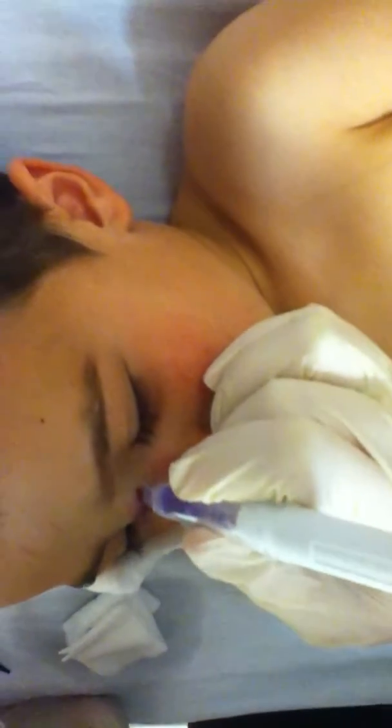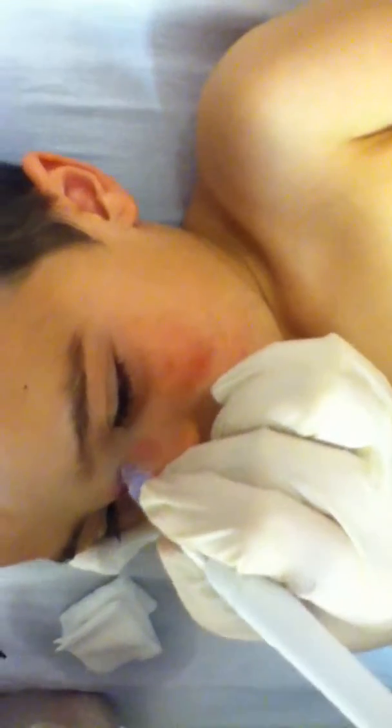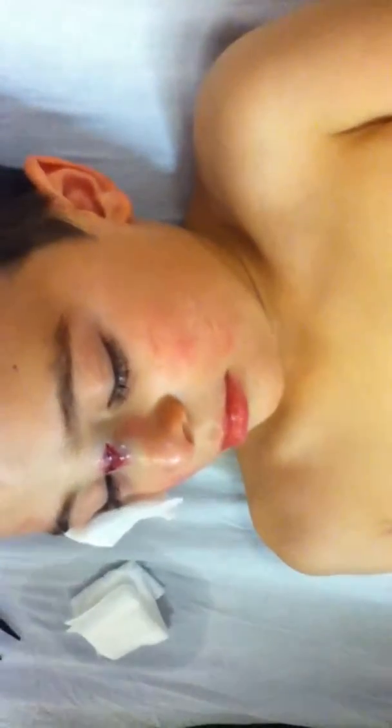And then we'll do another little thing, but this one won't sting because you already have a layer on there. And that'll just come up by itself? Yeah, it wears off if you can avoid getting it wet. So you may have to just give them baths and avoid this area. The longer it'll stay. If you can get it to stay on for about five days, the better it'll heal. Same with the Steri-Strips, because I'm gonna reinforce it with that.